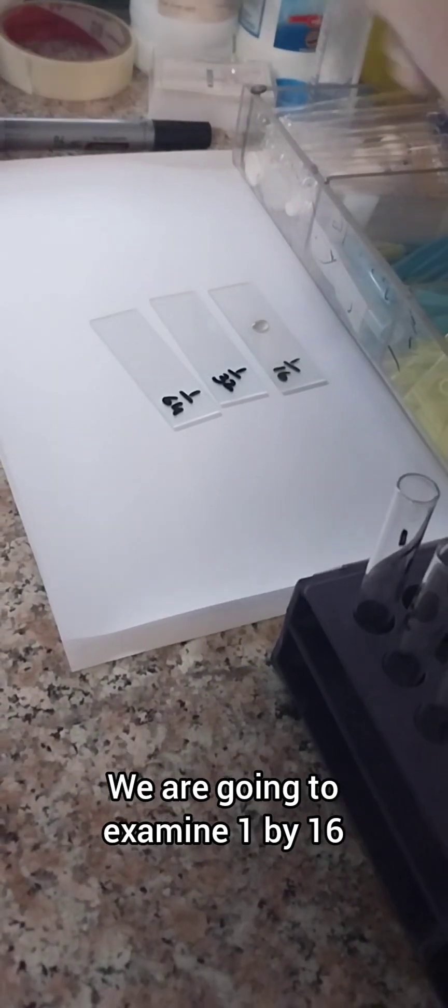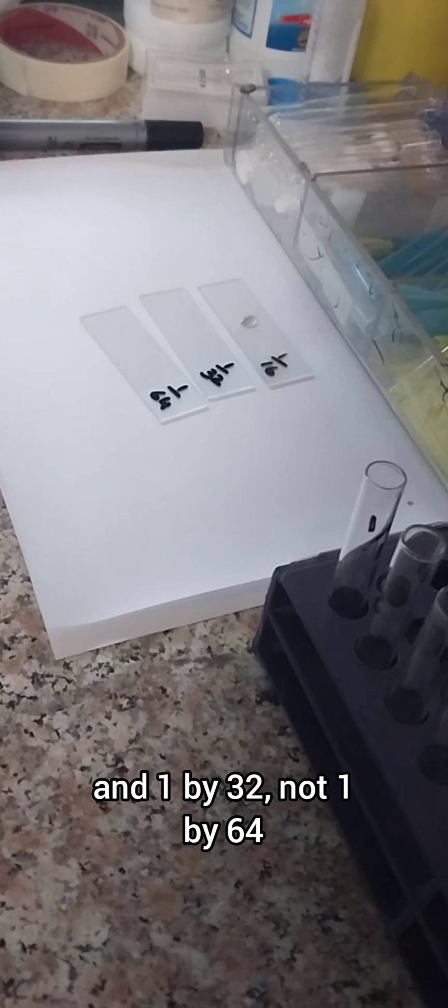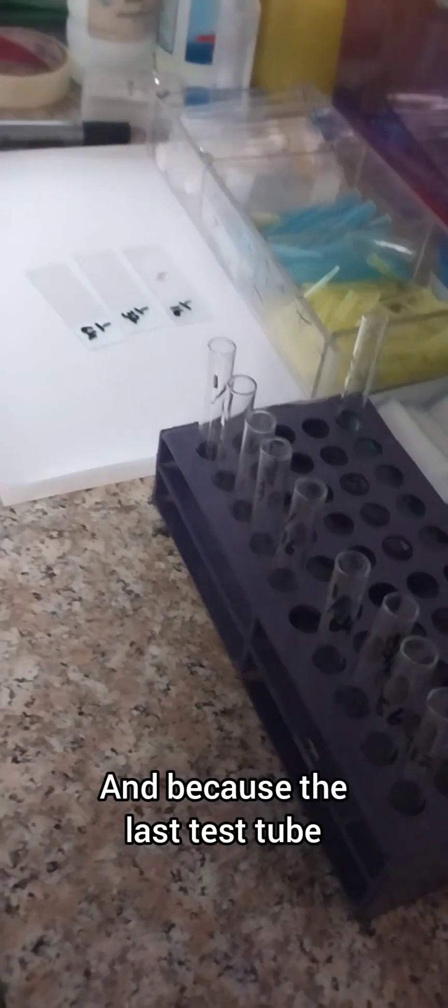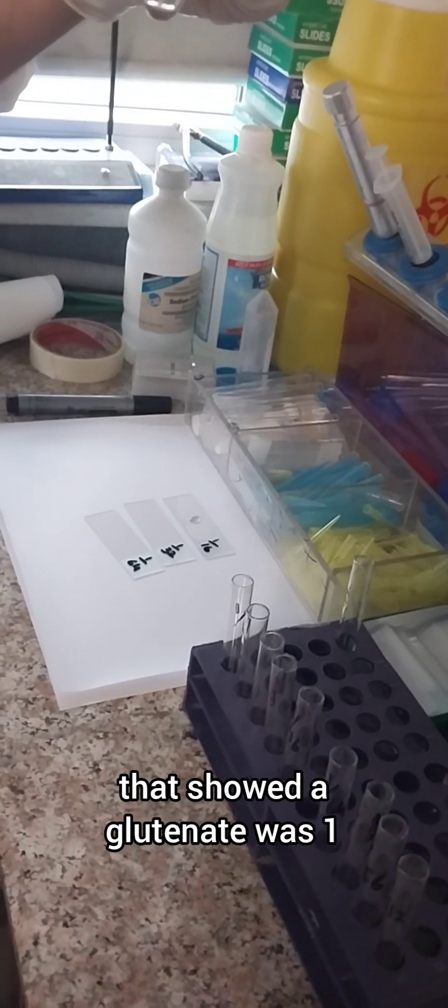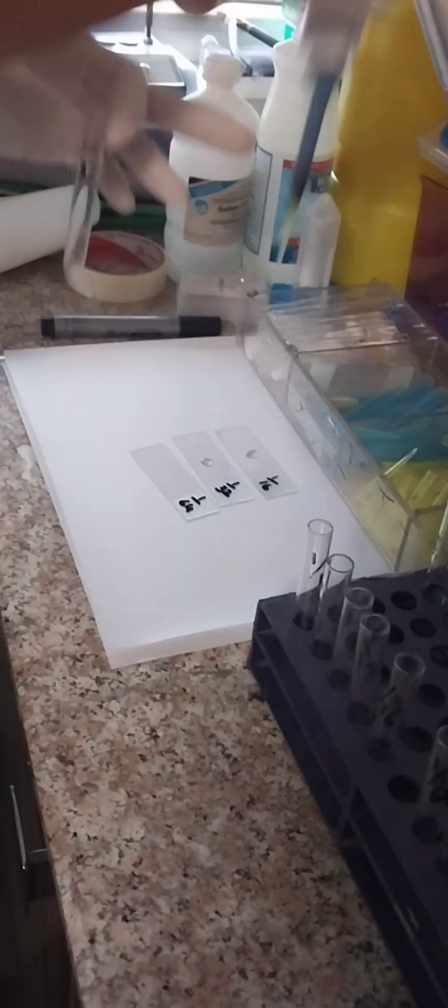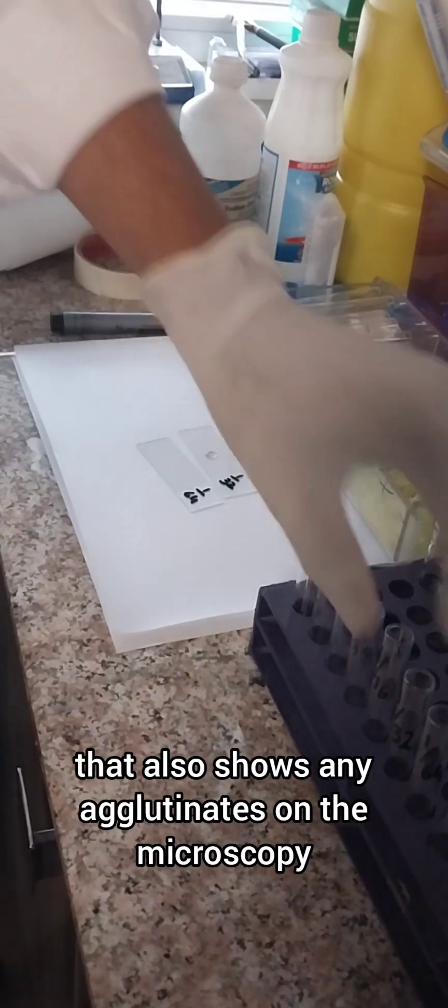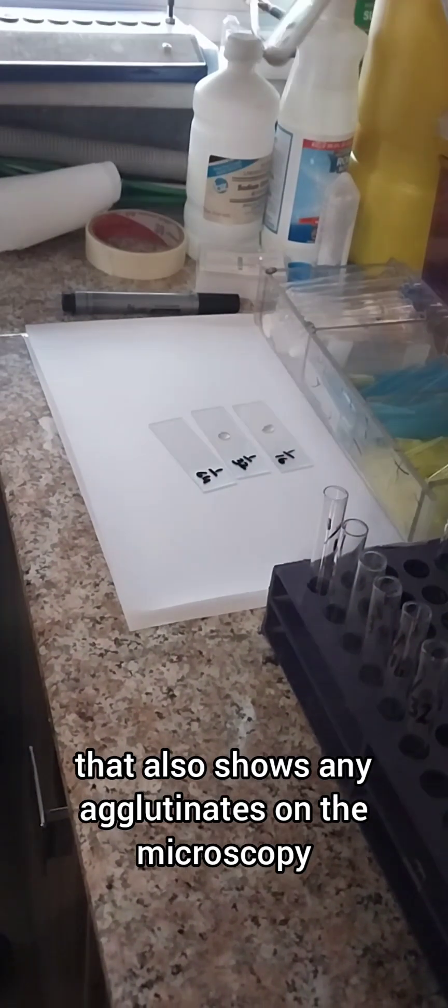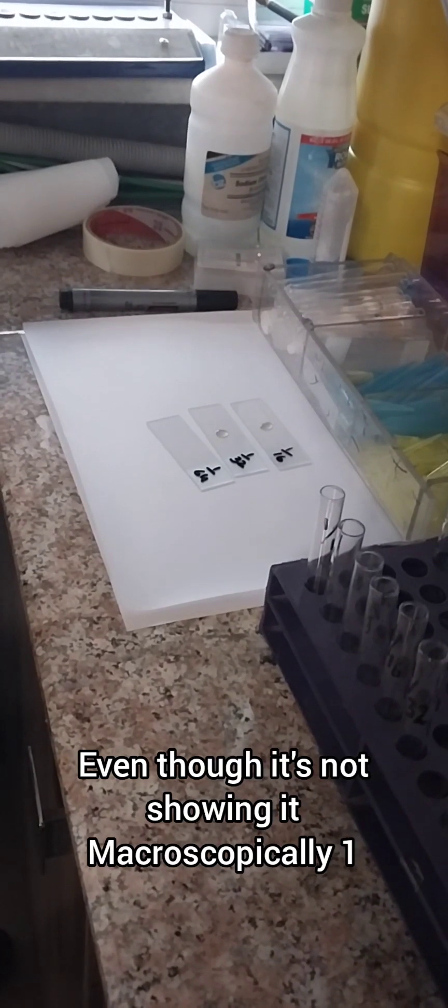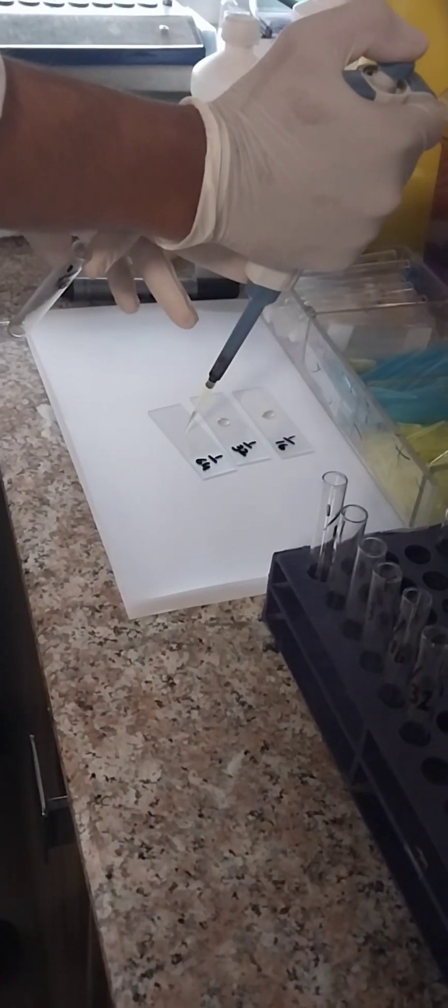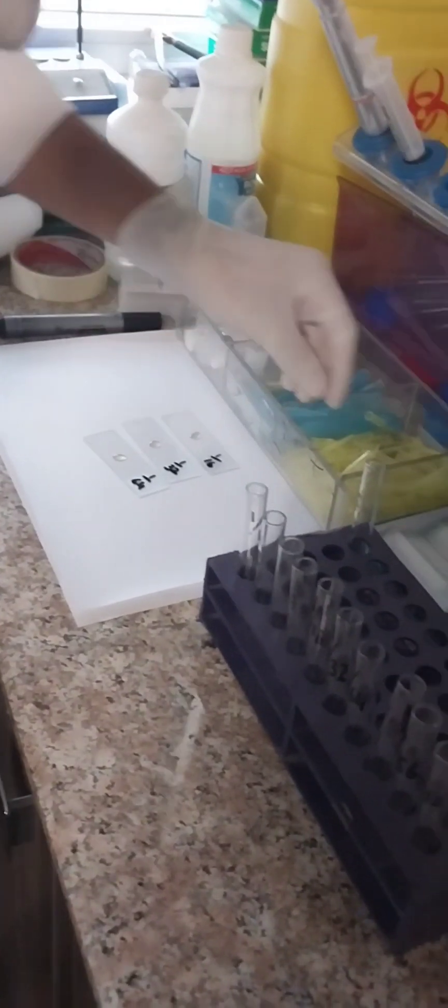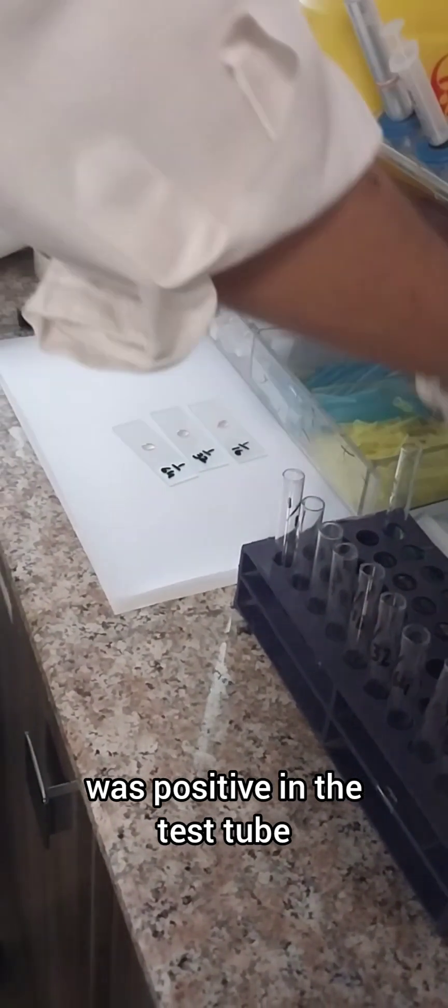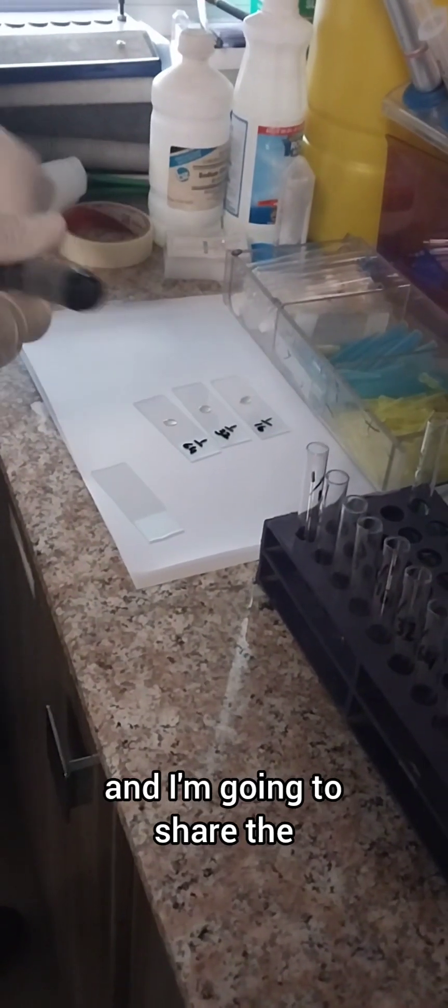The last step in RH antibody will be making the slide. We are going to examine 1:16 and 1:32, not 1:64, because the last test tube that showed agglutinates was 1:8. So I'm just going to see 1:16 and see whether that also shows any agglutinates on the microscopy, even though it's not showing it macroscopically. Only 1:8 was positive in the test tube. Now I'm going to see the slide and share the microscopic view with you.